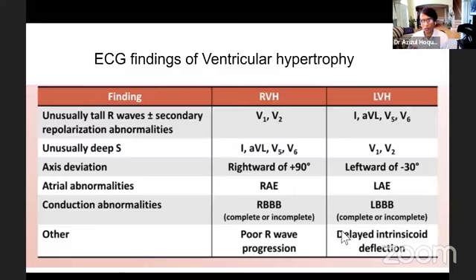One is pressure overload or afterload, where stress is high or afterload is high in a certain area, and valvular problems, but they are also connected, okay? So that is one component they have to keep in mind, and the second component is the axis on the ECG, okay?